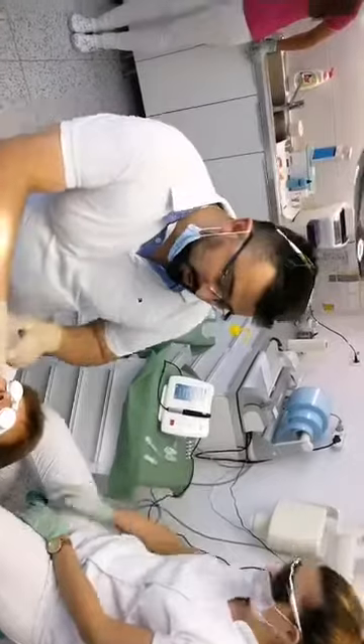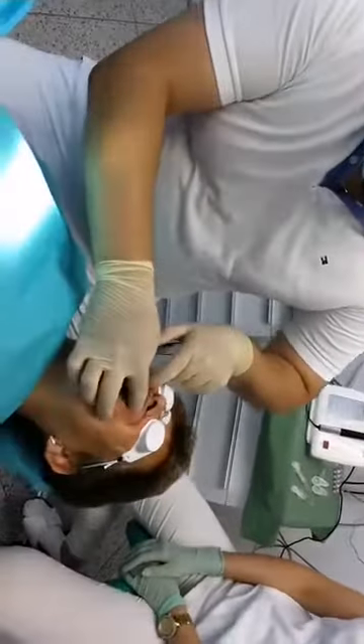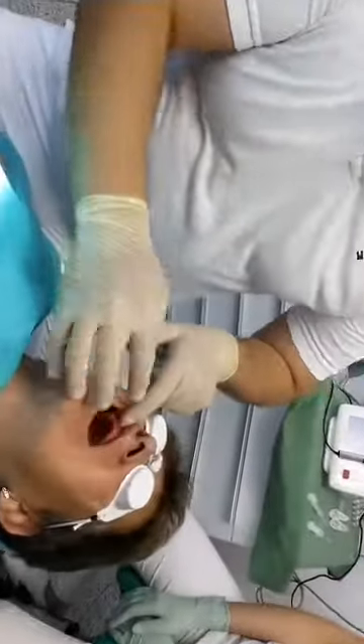The patient does not have suitable conditions for new total dentures, so we need to create more space for new total dentures.